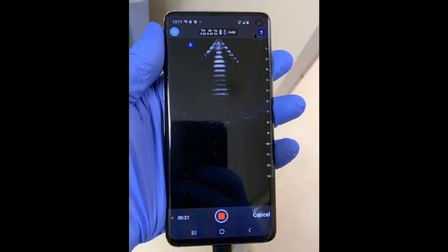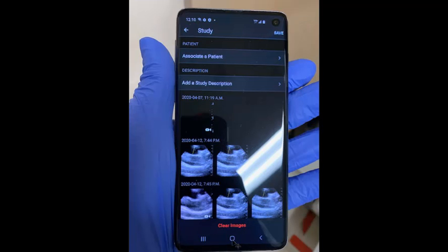If, on the other hand, you hit this button on the top right with the blue box, which is where the archives live, you'll be brought to a screen that looks like this. In order to get back to the usual screen, just hit this left-hand arrow on the top left of the screen, and you'll be brought back to where you want to be.